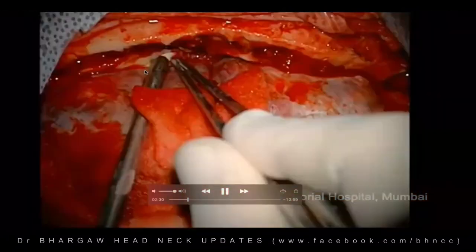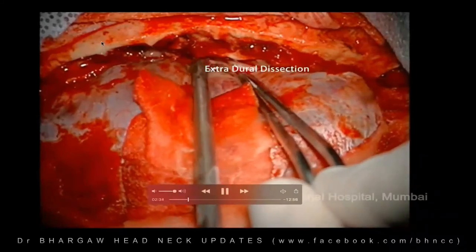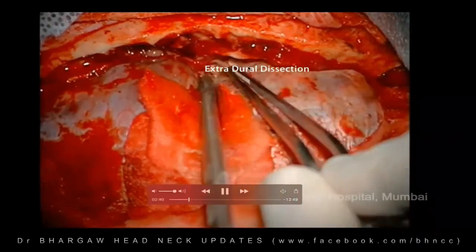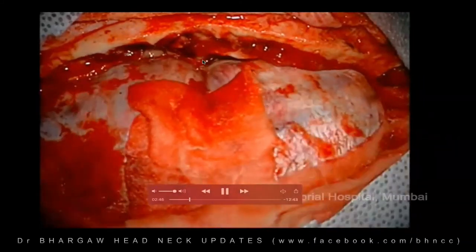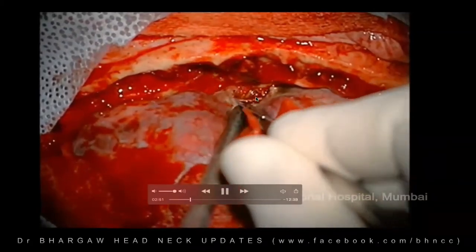So we have removed the posterior wall here, and then we are dissecting the dura from the cribriform area. Extradural dissection is being done superiorly. This is done under the microscope here. This is the picture from the microscope, so at some point it will become a bit blurred. That's the area of the disease there. You can start seeing the disease here.